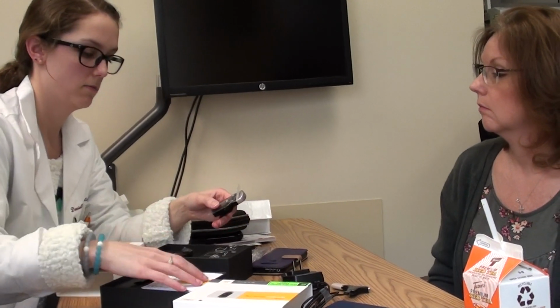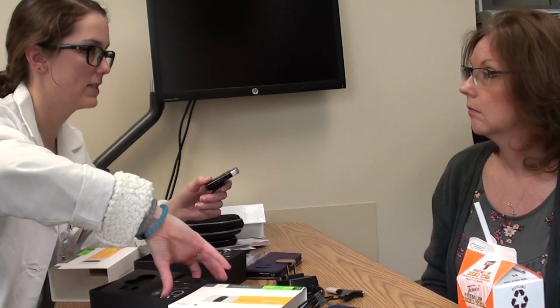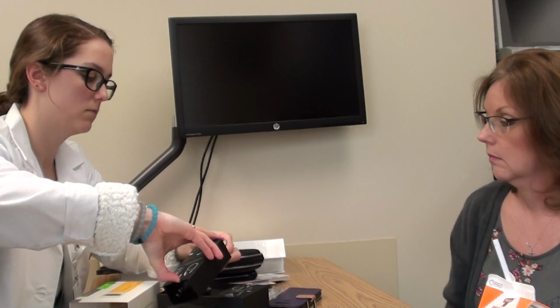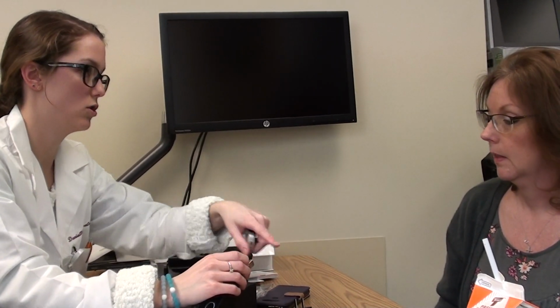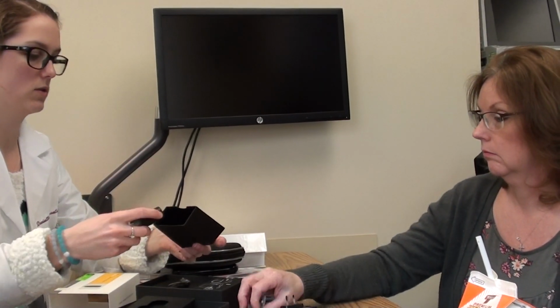So you'll wanna charge that, and then also this one. I don't wanna get them all mixed up. And then same thing, you're gonna plug this charger into this port on the bottom. So this piece again, and that's the same thing as those two, okay? And it has one of those as well.